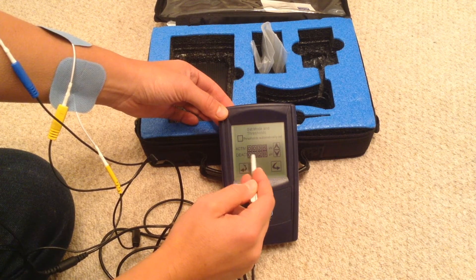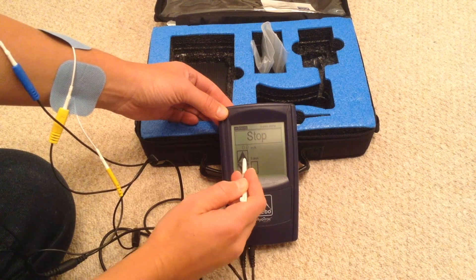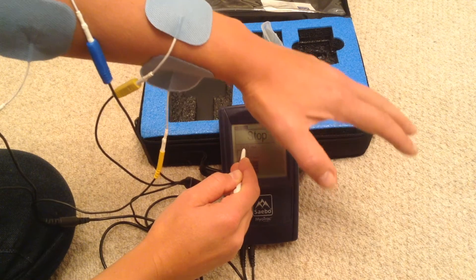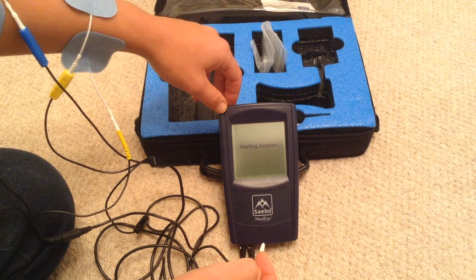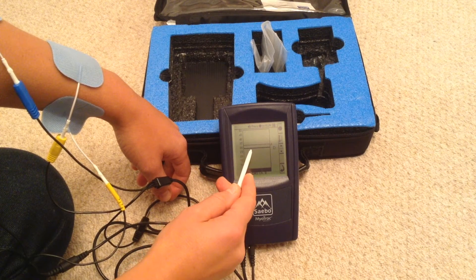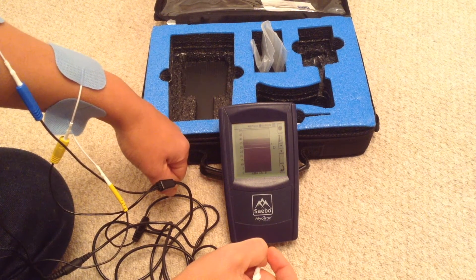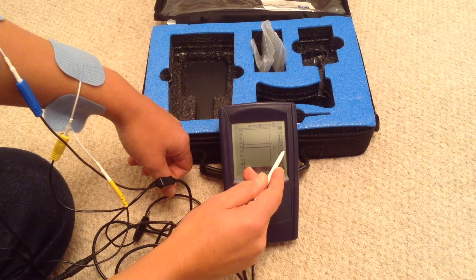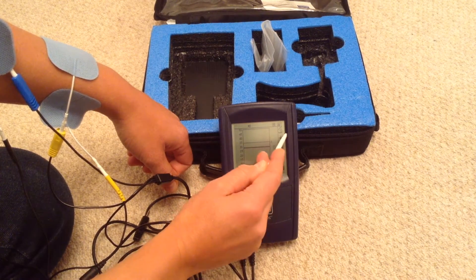They may not be able to switch off enough to go beneath the deactivation threshold, so I would increase that. Going forwards, I want to preset the amount of stimulation they would get. So this is looking at wrist and finger extension. I'm happy with the amount of opening, then I would click stop. Going into the program, you see here I've got A for activation threshold and D for deactivation. So if I squeeze, it detects the forearm flexors — they go above A, the device will then tell me to relax. As long as I drop beneath D, then the stimulation will come in. If I want to alter these thresholds, I'll go to the side menu. I've got A highlighted and I can increase A; if I highlight D, I can decrease D.